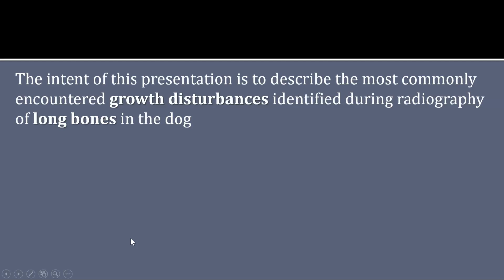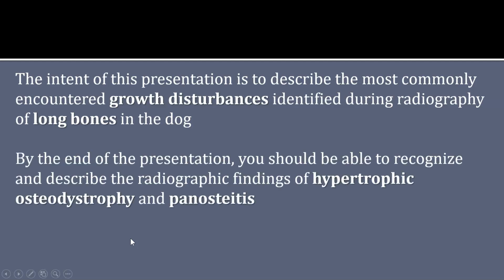At that point, you will need to use the skills that you've learned in your courses to identify and describe the lesions, and then have some good resources that you can search for differentials or reach out and consult with a specialist. By the end of this presentation, you should be able to recognize and describe the radiographic findings of hypertrophic osteodystrophy and Panosteitis.